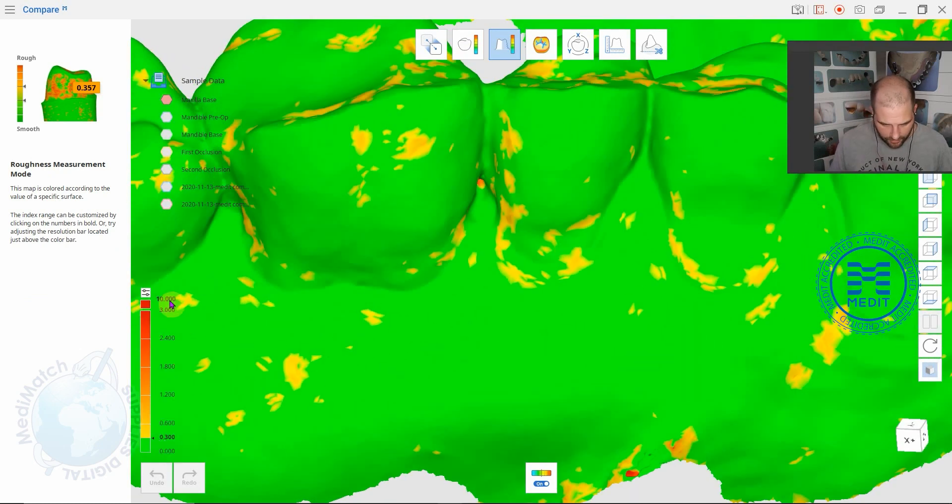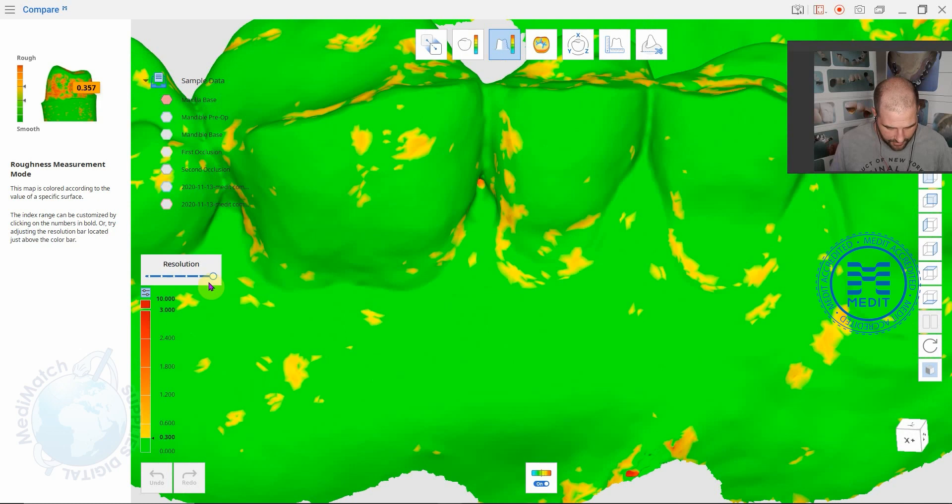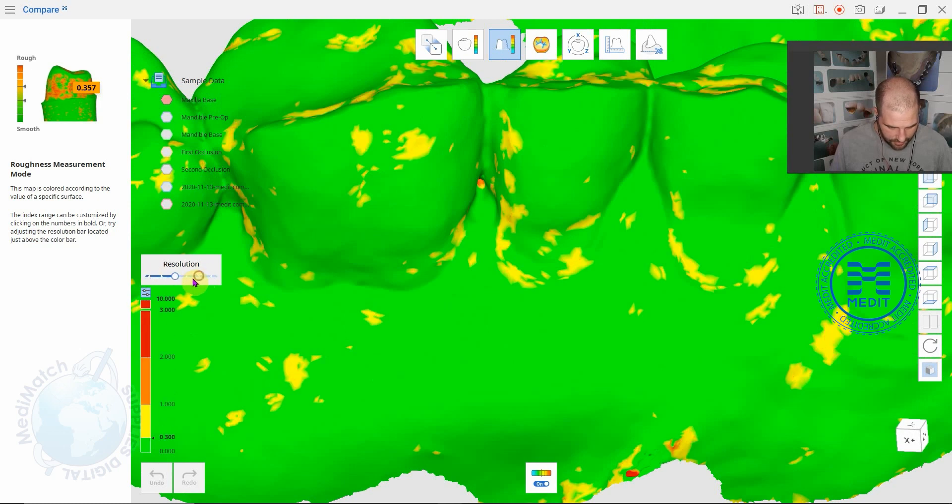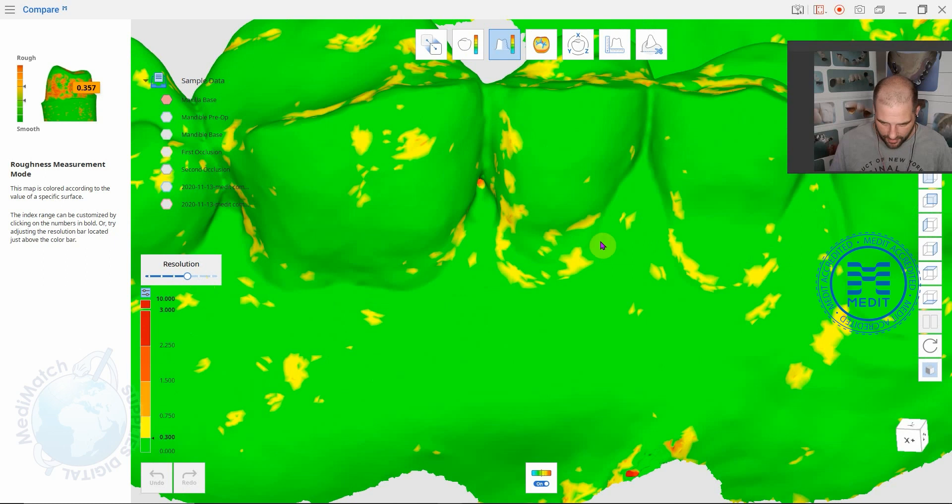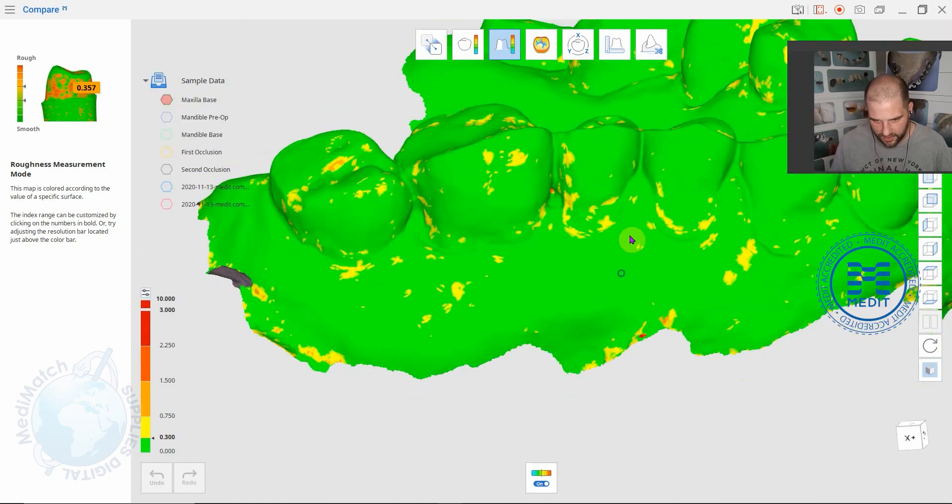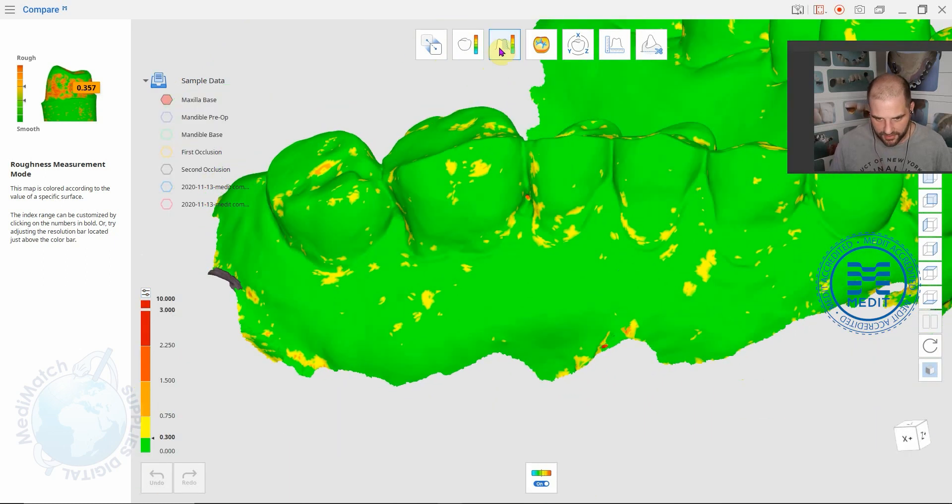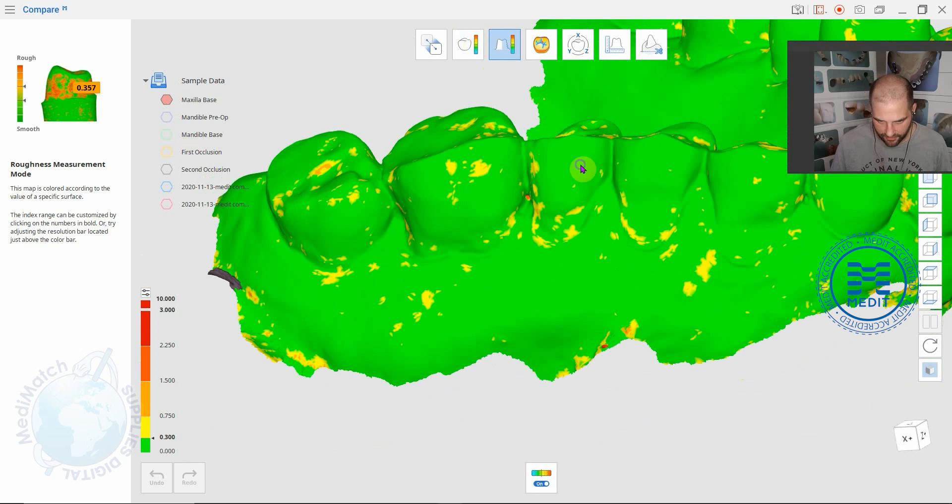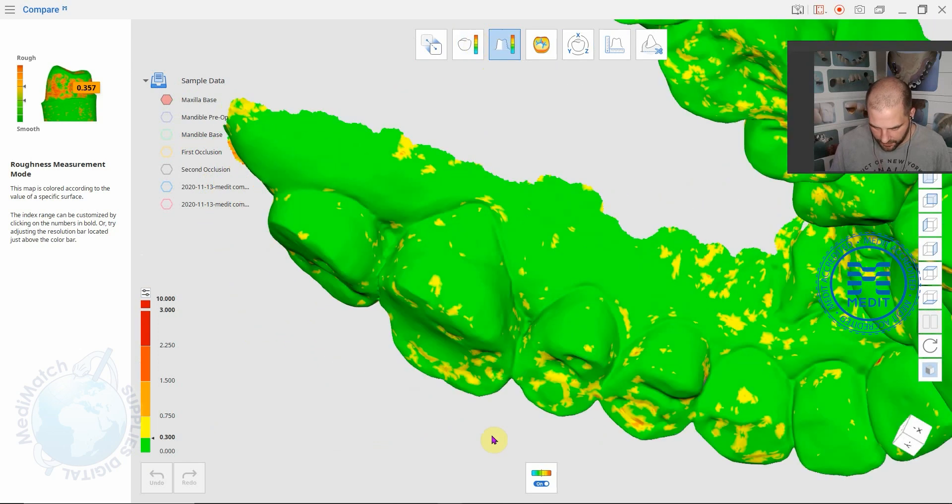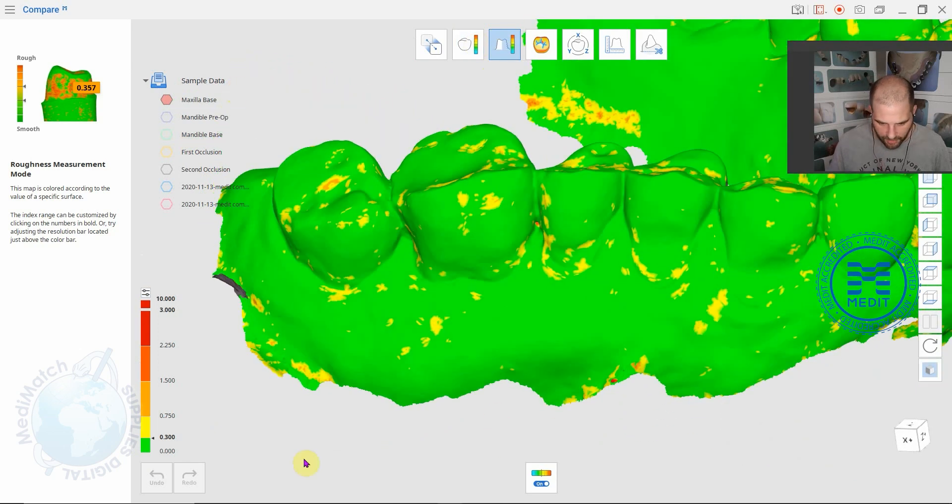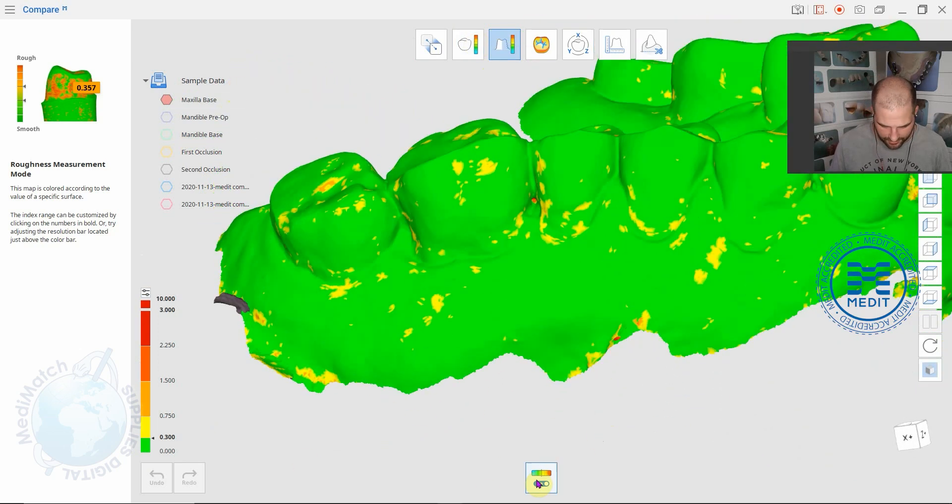If we move along to the next stage you've got a roughness measurement mode. You can play around with the scale here and it's just giving you a kind of a way of visualizing roughness in a 3D environment on a 2D screen. You can play around with that. Again you can turn it on and off here.